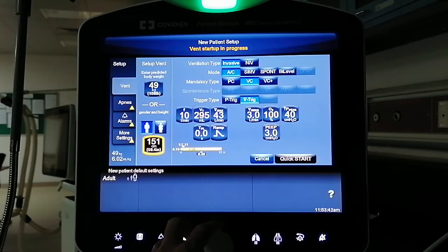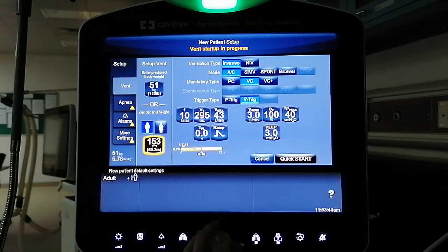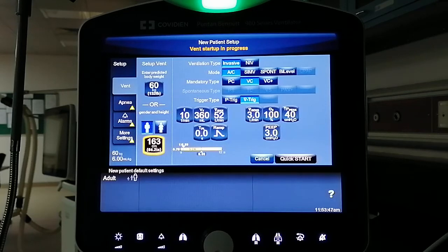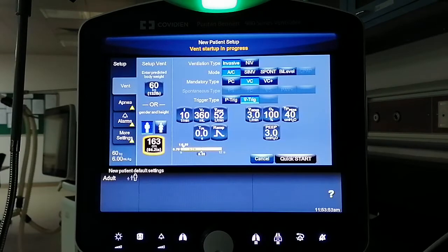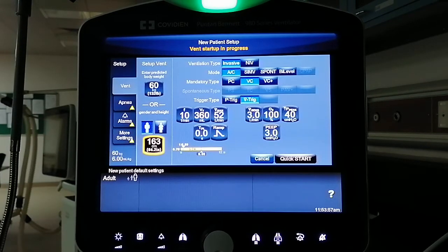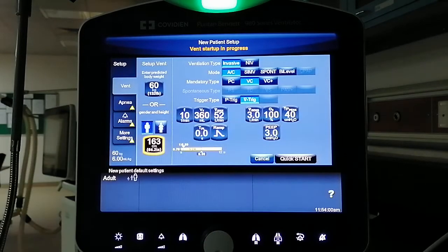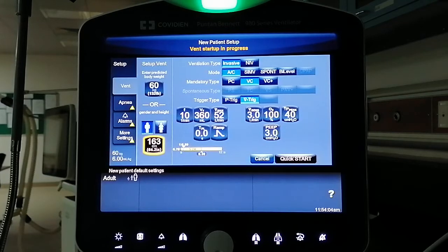Let's say the height is 160 centimeters. You can see that the predicted body weight in kilograms — similar to the Servo U — has the same calculated predicted body weight automatically.